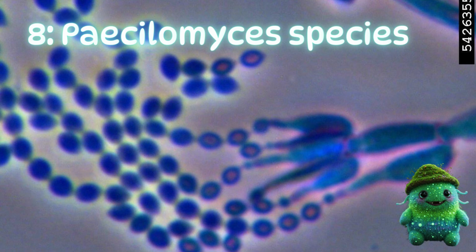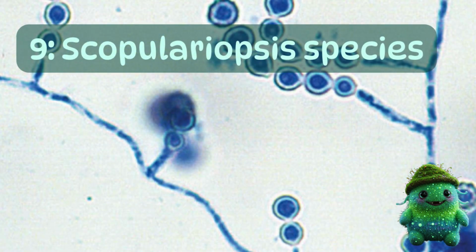On the cotton blue, Paecilomyces very closely resembles Penicillium, but with elongated phialides, especially at the tip. It has a more delicate look. Sometimes Paecilomyces structures are splayed out or arch away from the central axis. Since the phialides are elongated, they may resemble bowling pins. Scopulariopsis, on the other hand, is a more robust-looking Penicillium doppelganger with rough conidia in chains.